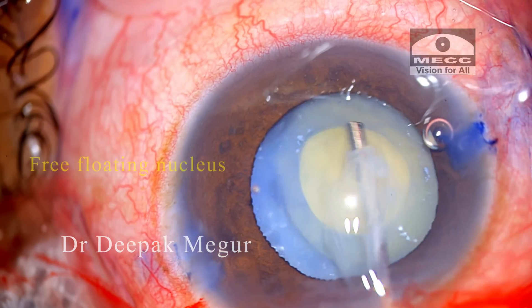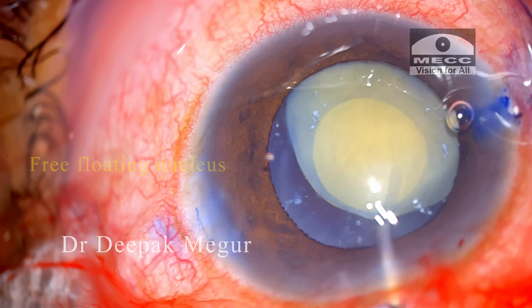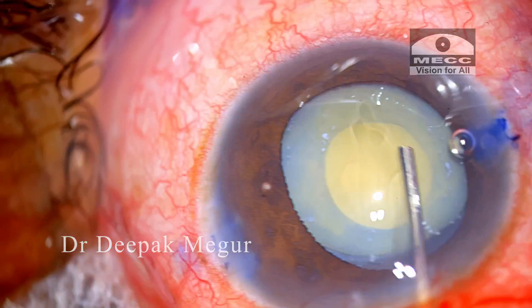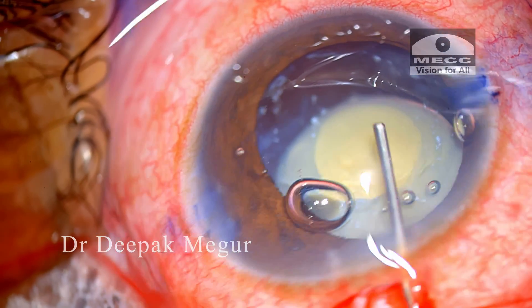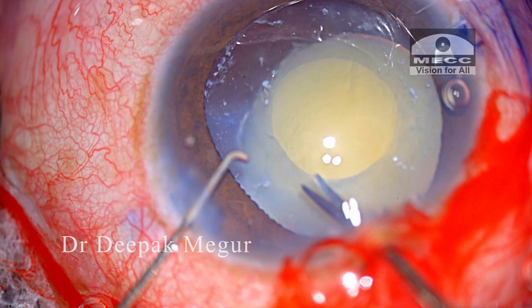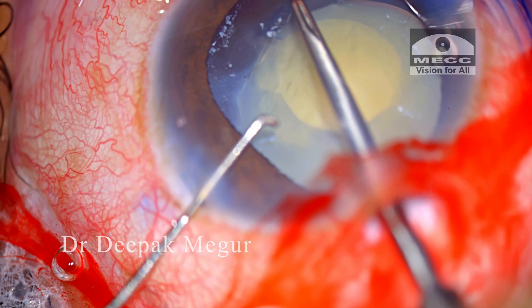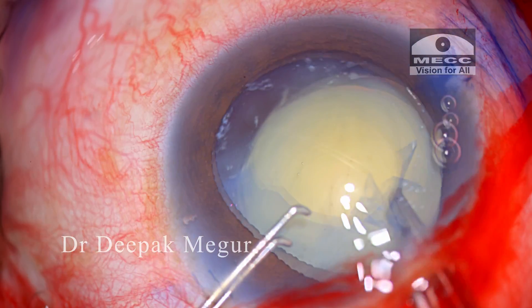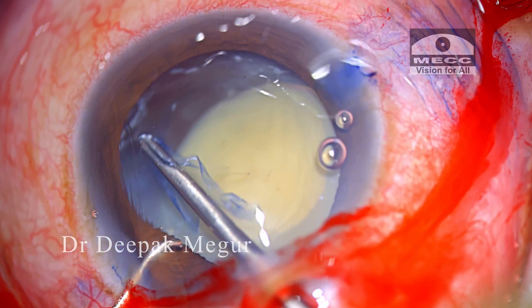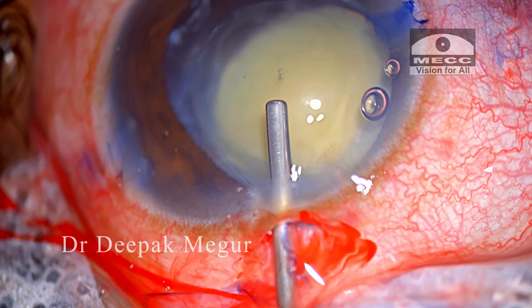The challenge is really with the management of the free-floating nucleus. The bag is quite loose and the posterior capsule appears to be quite floppy. The rhexis is eventually completed under the cover of OVD and it seems to be of a decent size. While performing the rhexis, I could sense that the zonules are not very healthy.